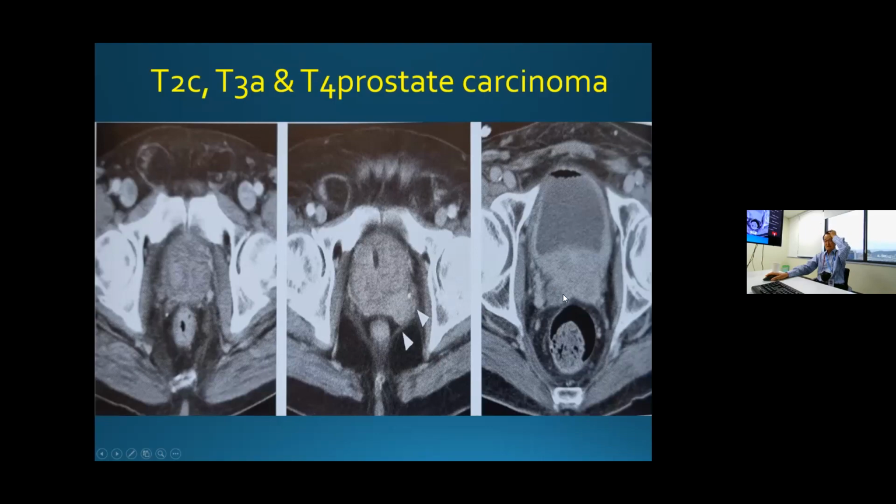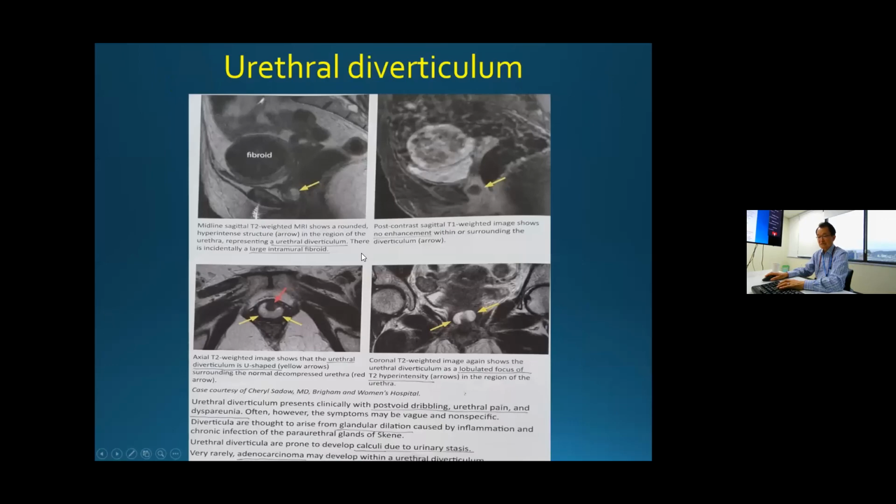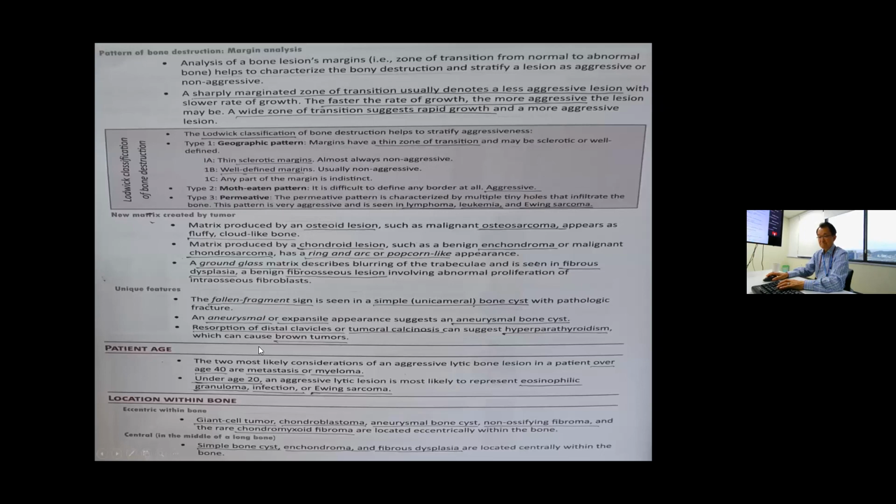Okay, here's a urethral diverticulum, you can see. In the last few minutes, when you deal with a bone lesion, you have to first analyze by pattern recognition.